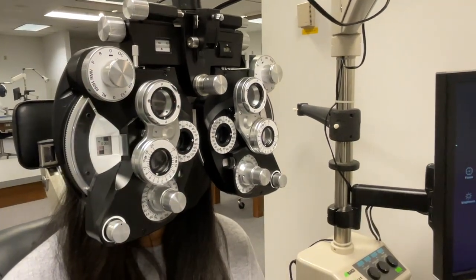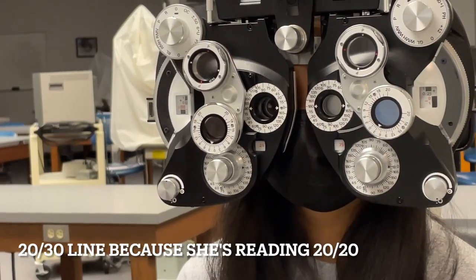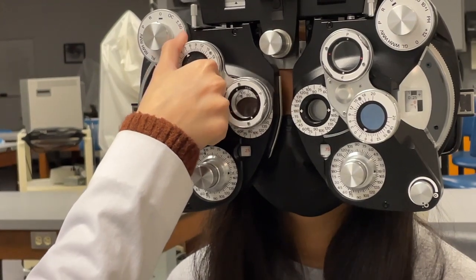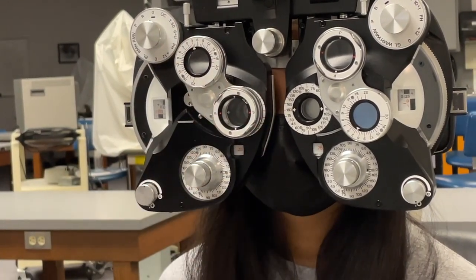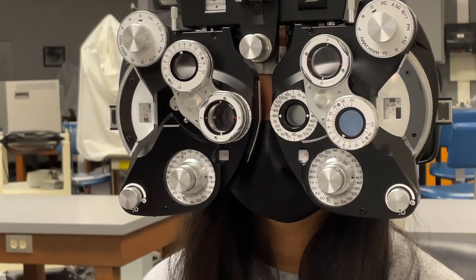All right, now I'm gonna move the line to a 20-30 line. All right, Mrs. Lee, I'm now going to be performing JCC. I'm going to give you 2 options, 1 or 2. You let me know which one looks clearer. And if they look the same, you can just let me know that as well.